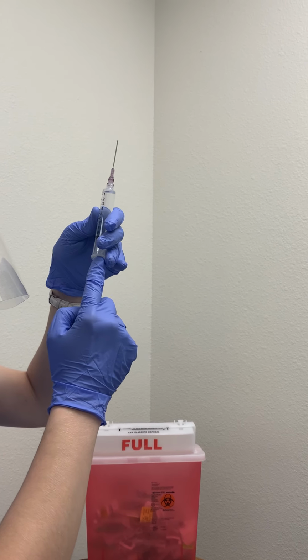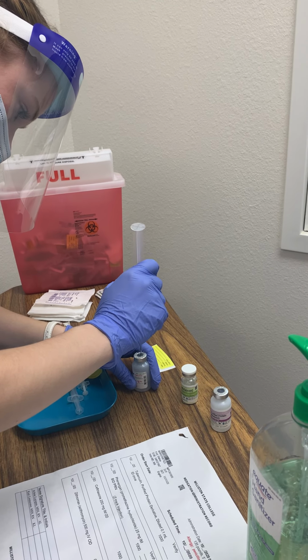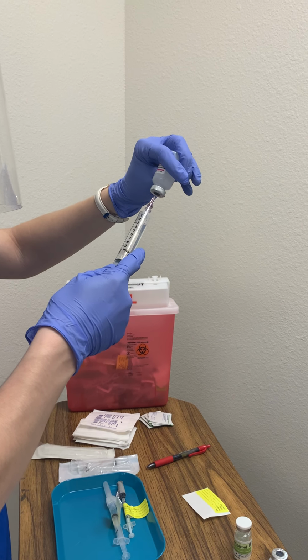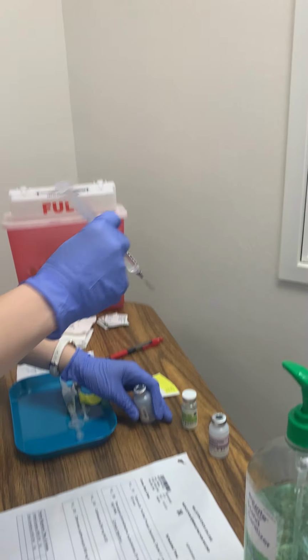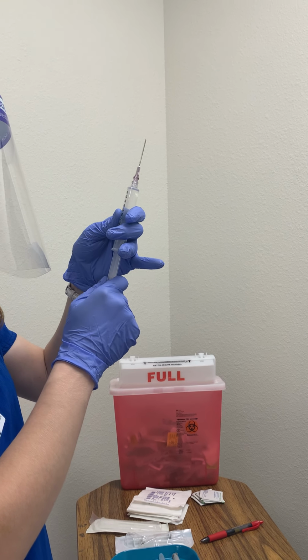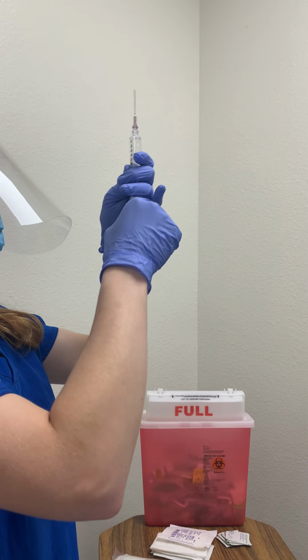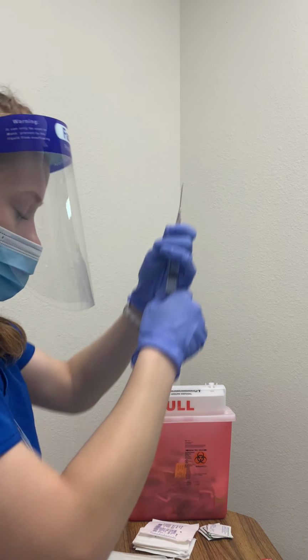So here I need a little bit more, so let me just push up. Perfect. So I've got my 10 mils.